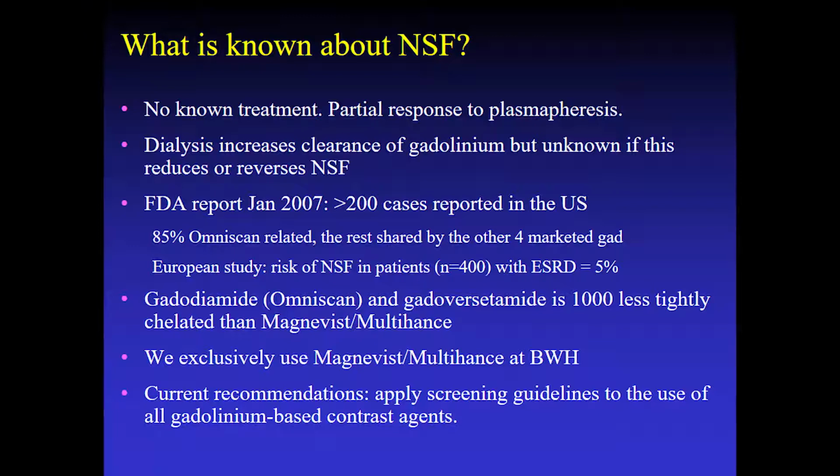I want to finish off in the next few minutes with some of the contraindications for MRI scan that you should be concerned about. There's a condition known as nephrogenic systemic fibrosis, or NSF, that many of you may already be familiar with. It is associated with gadolinium administration. It is specifically related to patients with severe underlying renal dysfunction.